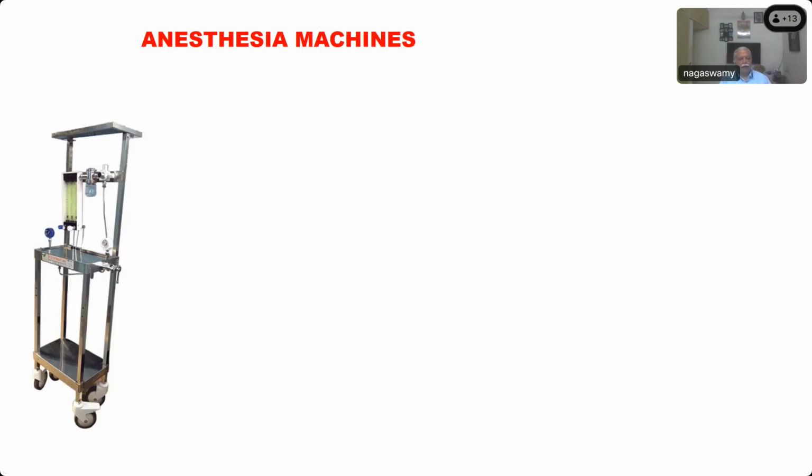The modern anesthesia workstations which you use, do you have a spare compressed gas cylinder mounted in the machine? Behind the workstation. Yes, sir. It is at the backside of the anesthesia machine. Majority of the times it is not visible, isn't it? So here this is the basic model where you can fix only one cylinder and one nitrous oxide. You see at the back also you won't find anything extra.